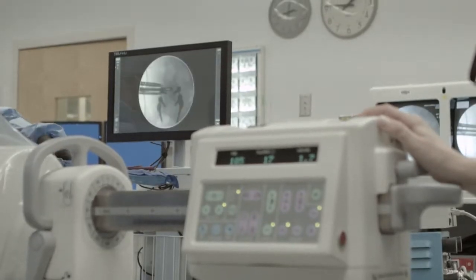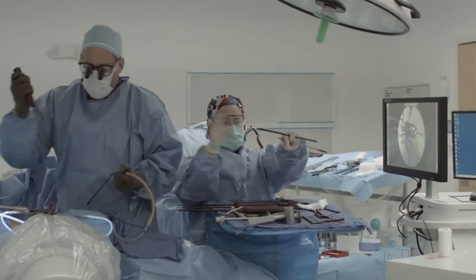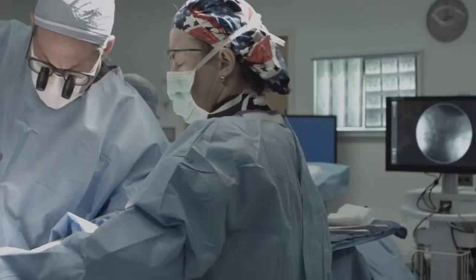It allows me to have better images at any given radiation dosage. So in certain cases, not just reducing the radiation, it's the ability to actually enhance an image that would be difficult. An instance of that would be, say, a mid-thoracic case where we're having difficulty visualizing the anatomy, or perhaps even obese patients, the ability to work really hard to get those initial shots and then to use the enhancement software after that.